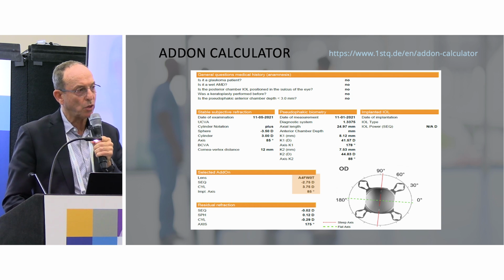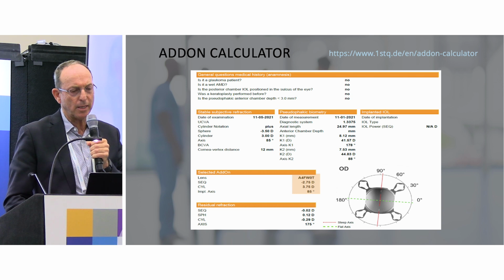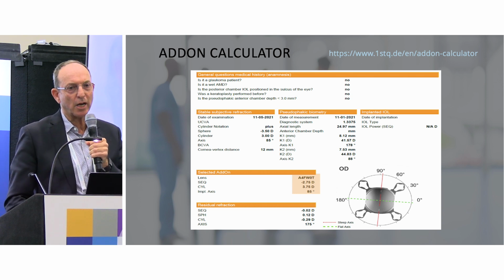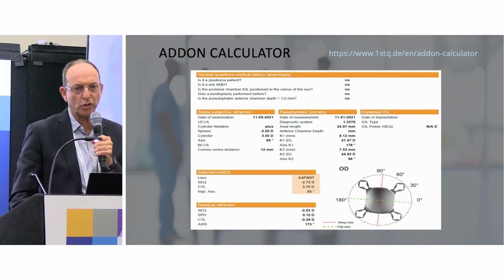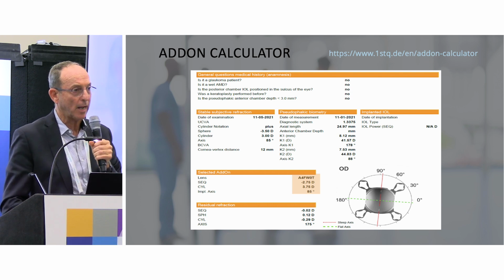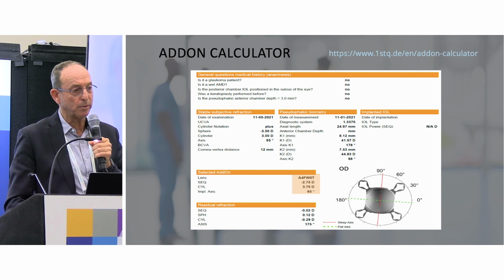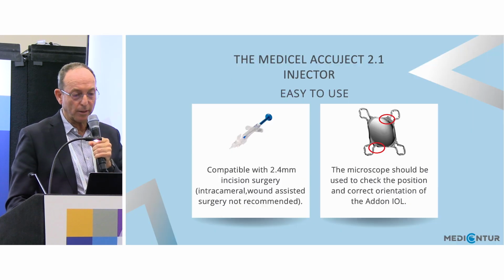This is for a toric add-on, and that's what I've used in the post-keratoplasty patients, where I can't trust my topography data. I've got too much information across different machines, not explaining the axis adequately. Usually we've got the power right. So those are the 2 times I've used this lens quite aggressively in a planned procedure, and often as a primary event, do the one lens, do the other.